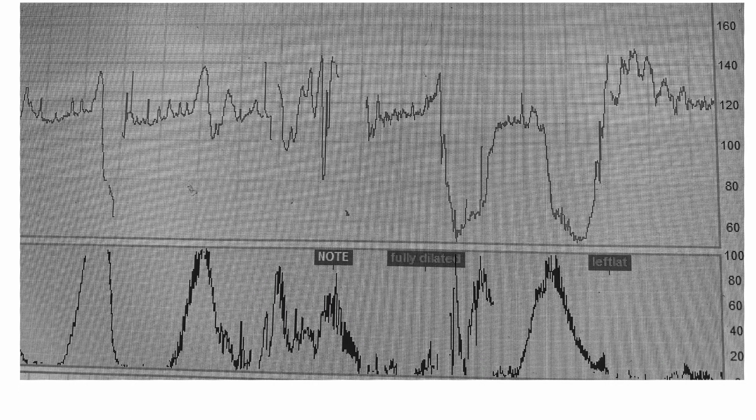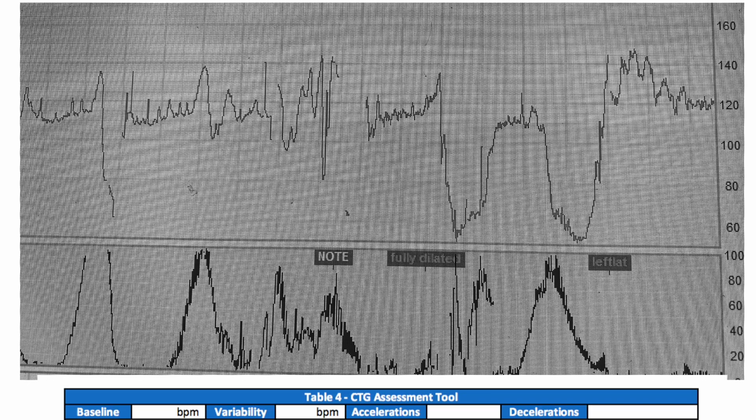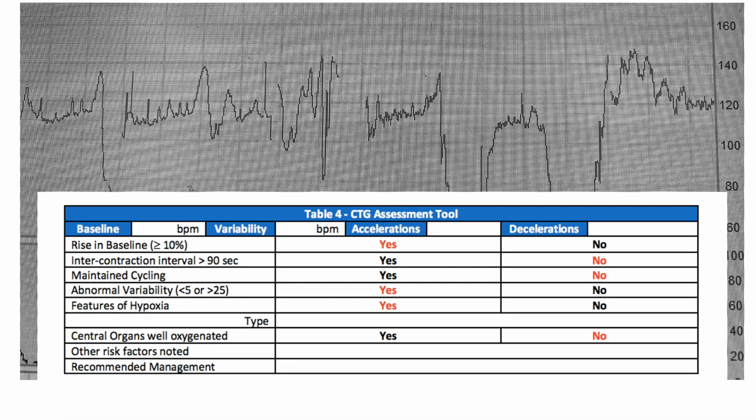If you see this CTG from a pattern recognition point of view, depending on the inter and intra-observer variation, this may be a suspicious or pathological trace. But let's apply the physiological CTG guideline on this CTG trace. The baseline heart rate is about 120 beats per minute. The variability or the bandwidth is approximately 15 beats per minute. There are no accelerations, and we should not confuse the shoulders and the overshoots of variable decelerations as accelerations.